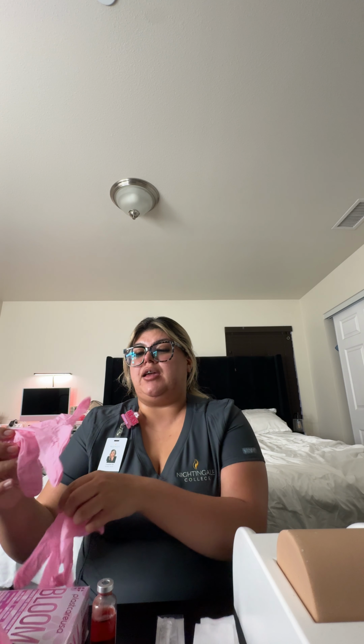Some adverse effects are blood in the urine, nosebleeds, or difficulty breathing. I do want to let you know that just with any injection, you will have some burning or stinging sensation at the injection site when I give the injection, but that should resolve pretty quickly. Do you have any questions before we get started? No? Okay. We're going to perform hand hygiene. I'm going to go ahead and put on a clean pair of gloves.